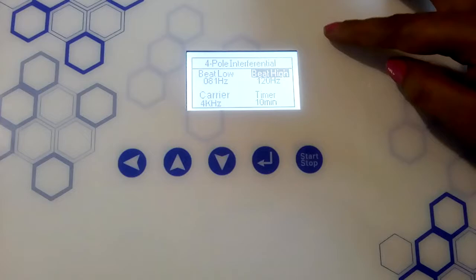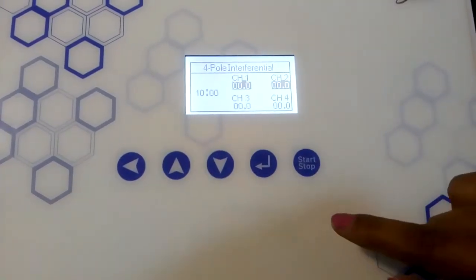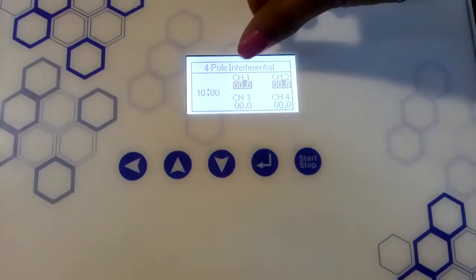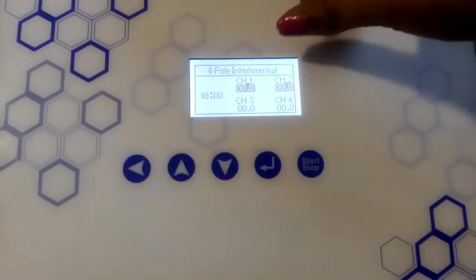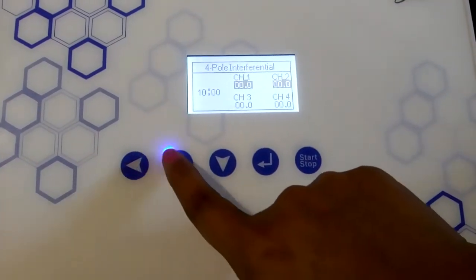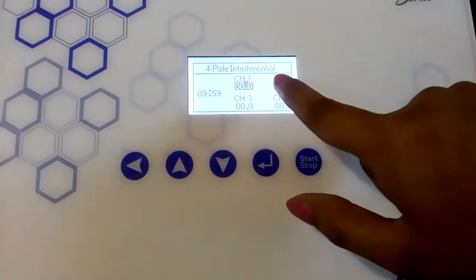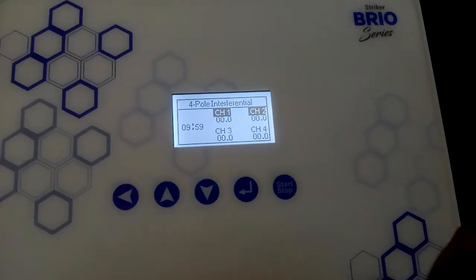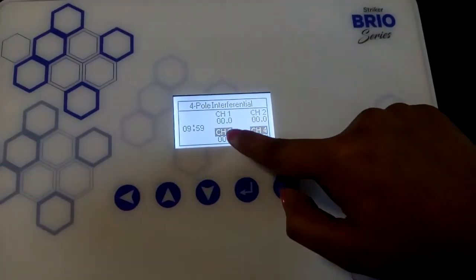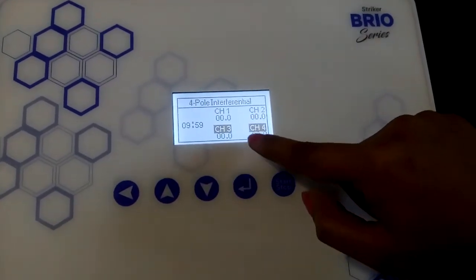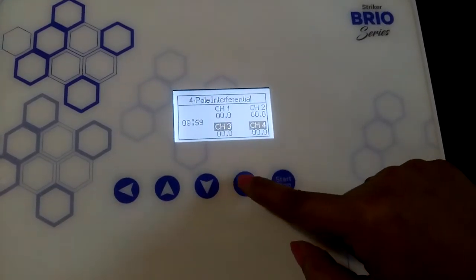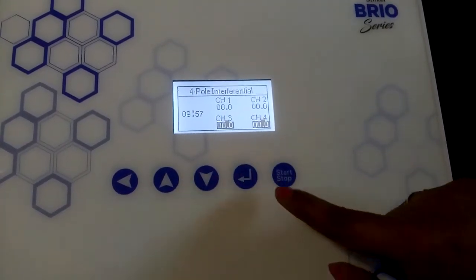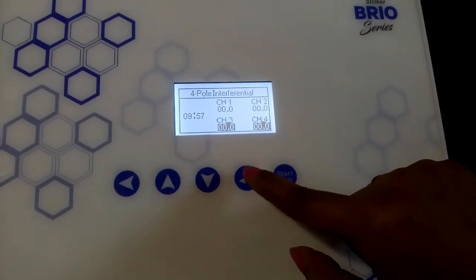After setting all the parameters, press the start button on the machine. The facility is provided to change channel 1 and channel 2 intensities together using the up and down buttons. To exit channel 1 and 2 intensity control, press the enter button once. Pressing the up button highlights channel 3 and channel 4. Press the enter button to adjust channel 3 and 4 intensity using the up and down buttons, then press enter to exit.